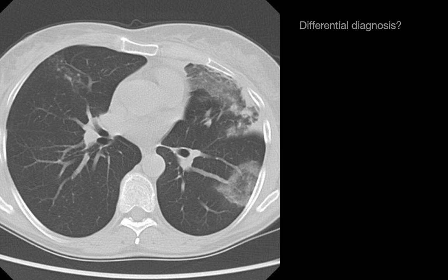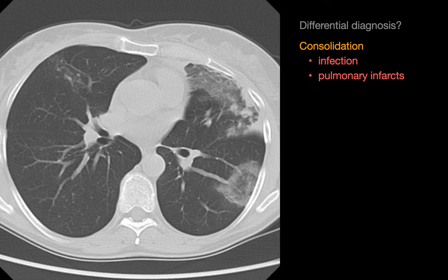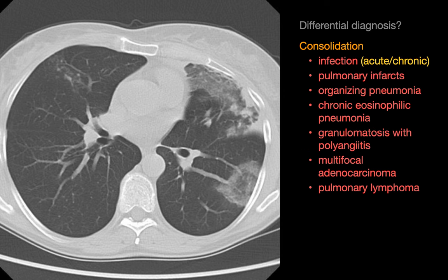The findings in this case are multiple, bilateral, predominantly peripheral regions of peribronchovascular consolidation and ground glass opacities. At least one focus in the lateral mid-left lung has a reverse halo appearance. Since anything that causes consolidation can also cause ground glass opacities, the differential diagnosis for this case will be primarily derived from our differential diagnosis for non-diffuse acute consolidation and chronic consolidation.